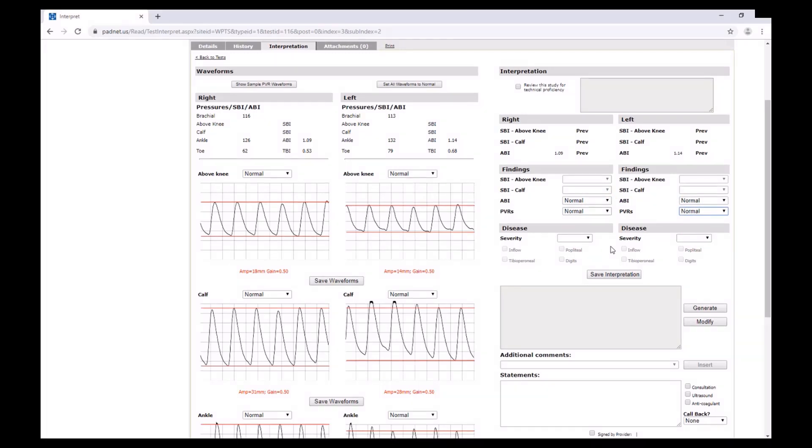To view a patient's history including BMI, former vascular procedures, and risk factors, click on the History tab right here. But for now, let's go back to the interpretation.